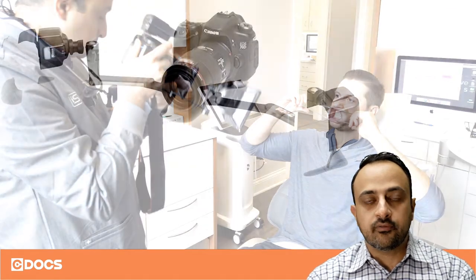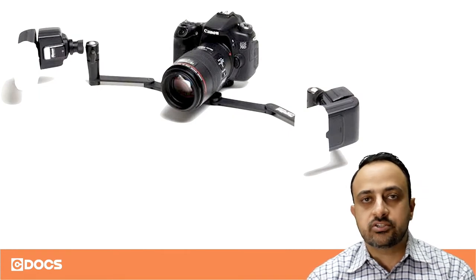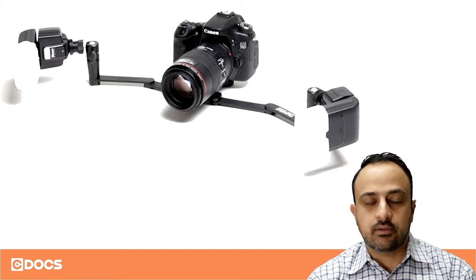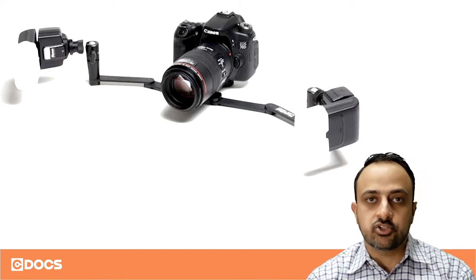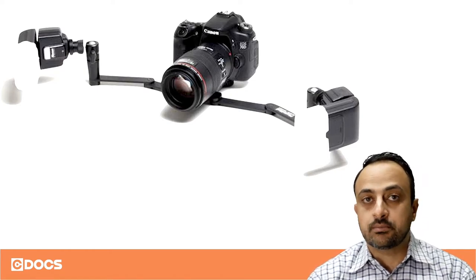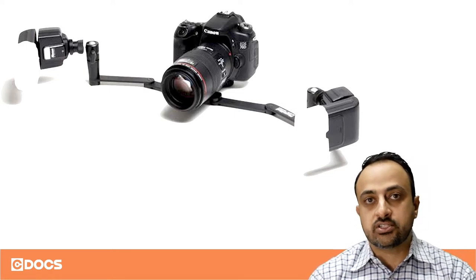A couple of the common camera setups — like the one you just saw me using — this is your traditional DSLR camera with a macro lens. The macro lens allows you to take high-resolution images of very small things like what we would do intra-orally. The biggest thing with any camera setup is going to be the lighting, and what you see on the screen here is a twin flash setup.